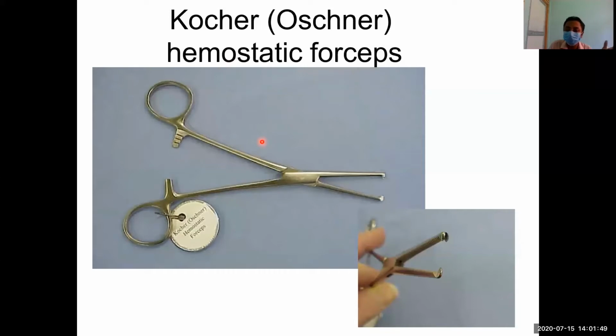Other normal hemostatic forceps like Spencer Wells, Kelly's, Adson's, Mosquito, will not have this tooth and groove assembly. So if we see a tooth and a groove assembly at the end of the blade, we are sure that it is Kocher's hemostatic forceps.